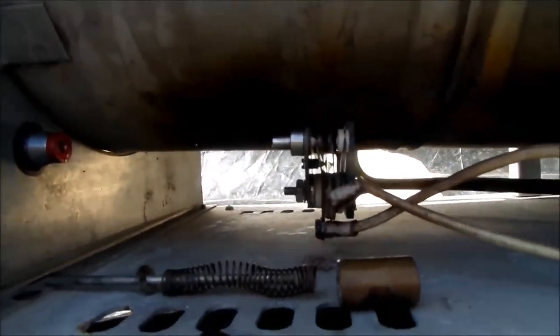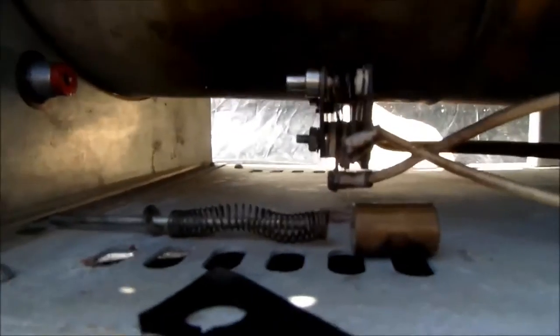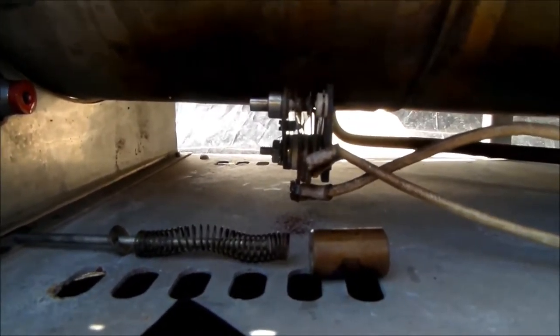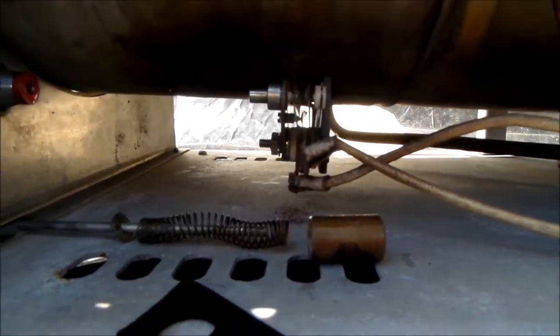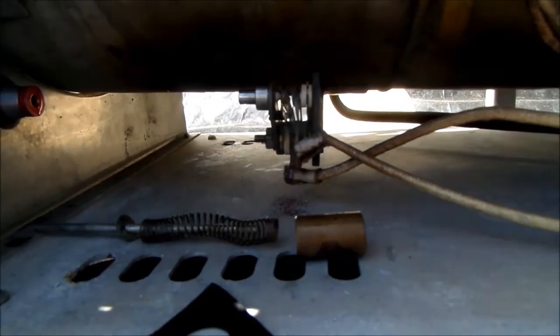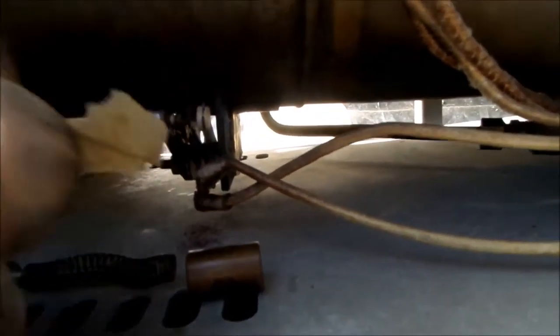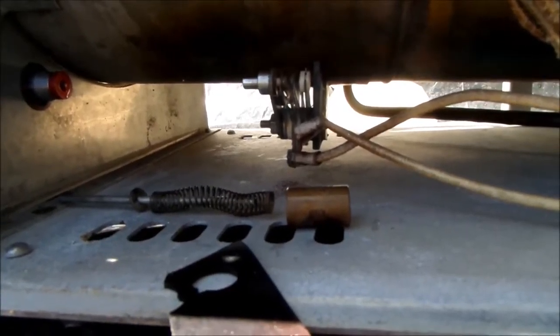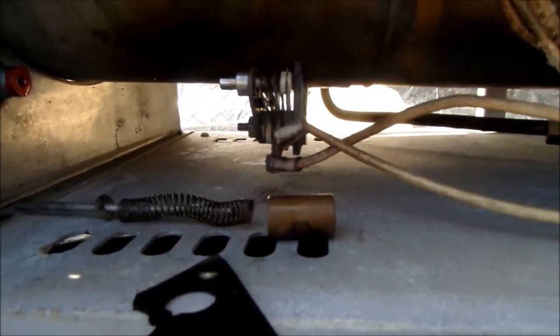What's important here is the temperature reset switch. We have to make sure these points are clean in here. I use a small piece of sandpaper to clean the points up and make sure that switch is functioning properly.